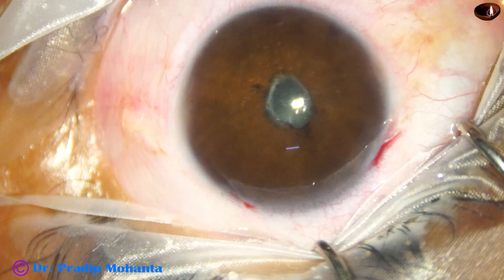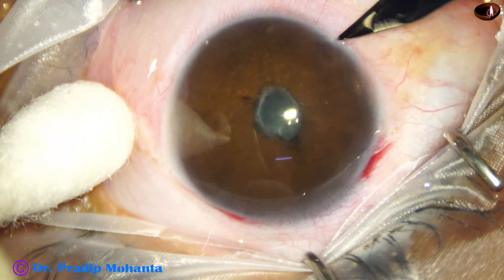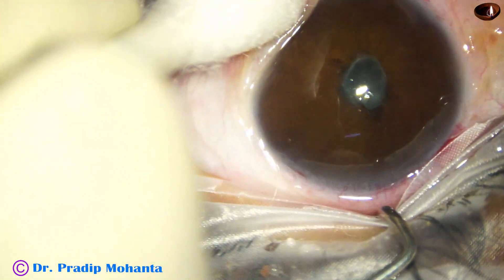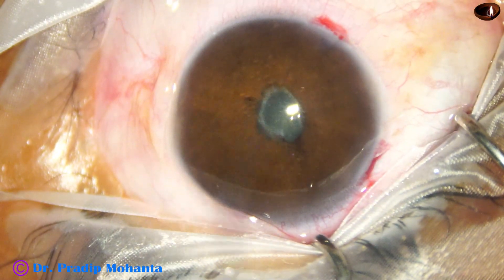This is a side port on the left side of the main incision, about 3 o'clock hours away. Another side port at around 8 o'clock, the same distance away on the right side of the main incision.